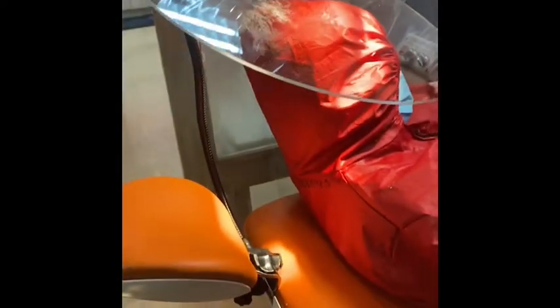Come back to you later. In fact, the shield — pinatouch namin sa dental chair, dito sa may headrest. All you have to do is just raise the headrest a little bit to expose some metal. Dito, naka-clamp ngayon. In my case, dito ko rin nagay kasi ito yung mas accessible sa akin. If you tilt mo lang, adjust mo lang yung shield kung saan ang preference mo.